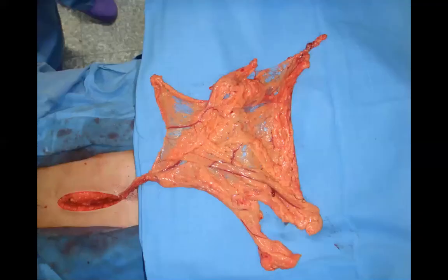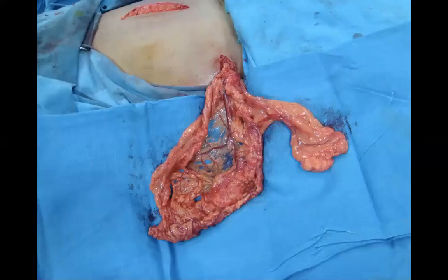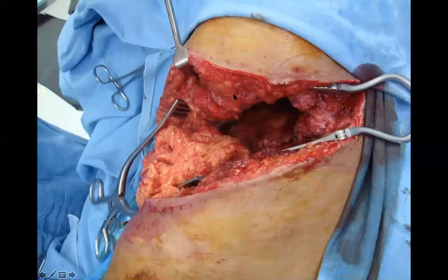So all we did was push the muscle onto the stump and then push the omentum across through a subcutaneous tunnel, came into the chest. And then here is the omentum coming from here.